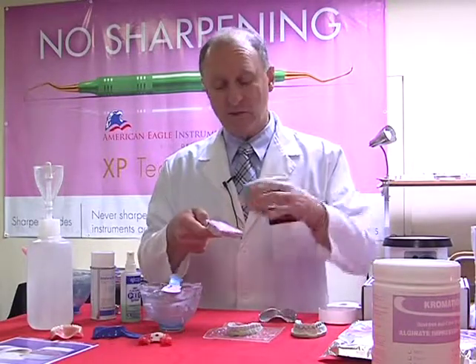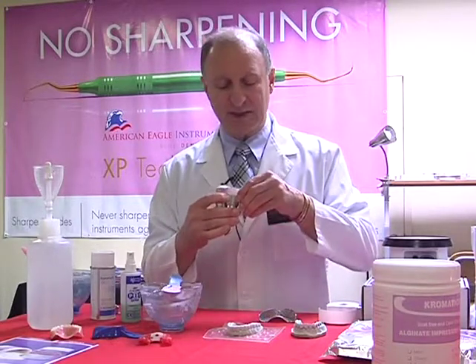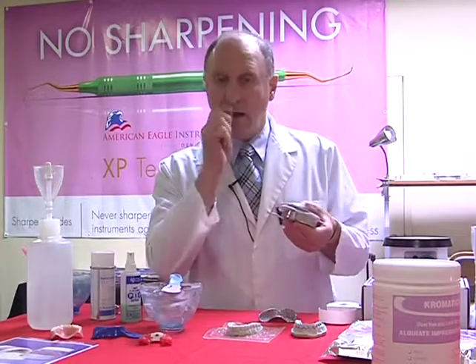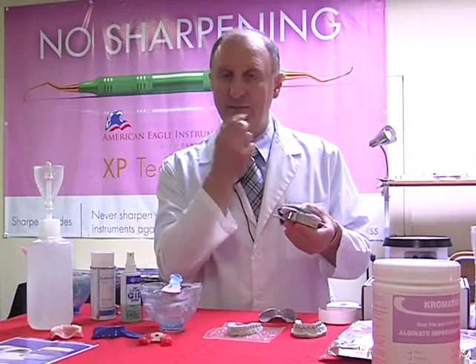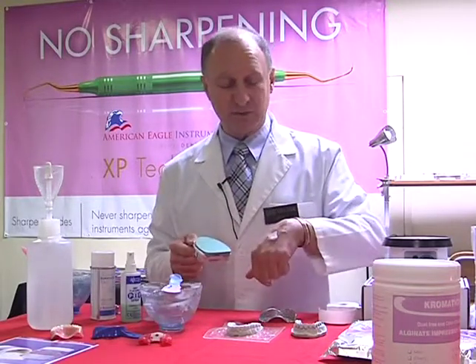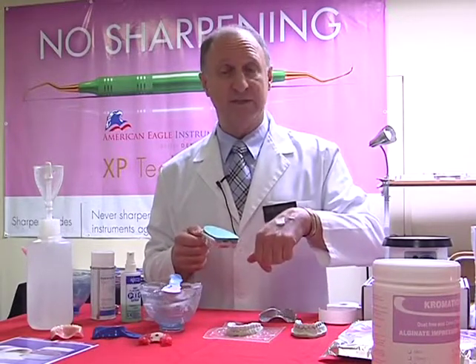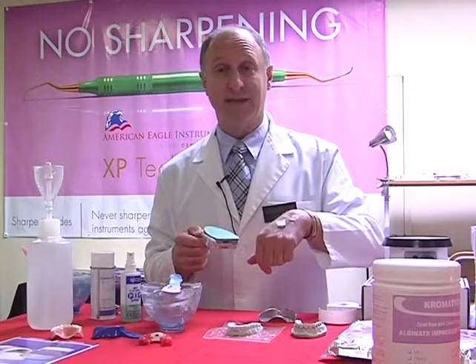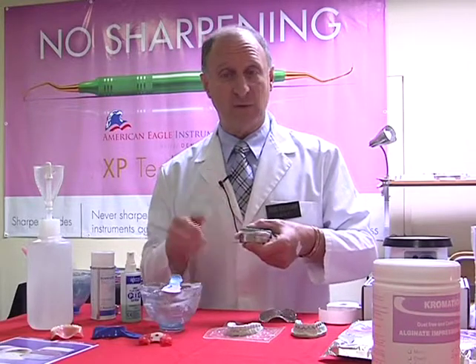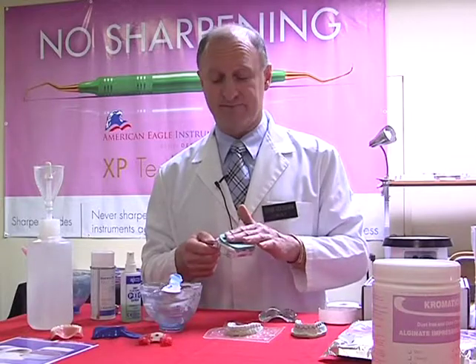So we're normally going into a wet mouth environment. As we go in, we apply a small amount of pressure, and normally I'll be pulling my lips down over and then muscle molding, getting a good functional impression. This material, as being a color change, as we can see, it changes from purple to pink to white. When it's white, we know the material's set, and that's normally within 60 seconds with the most alginates. But in this case, with this material, I've still got the same working ability, but it's only 20 seconds, so it's much faster, kinder to the patient.